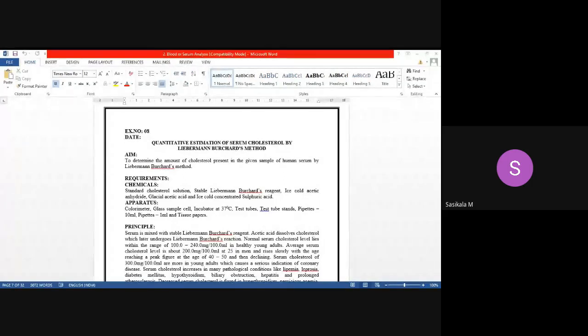Sometimes to improve the clot formation, we'll add some reagents, or else we allow the blood to clot, then the supernatant liquid is taken. And here anticoagulant is added in order to avoid the formation of clot. Once all the cells have been precipitated, the supernatant liquid will be plasma, where we can analyze the plasma proteins present in it.